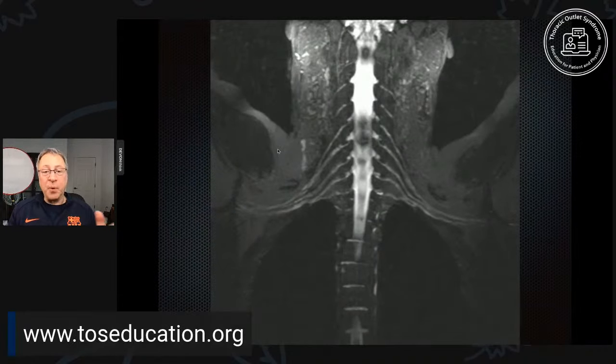And here's a picture of the brachial plexus on each side. We can lay out the brachial plexus, separate it out from the rest of the soft tissues. No other modality can do it this cleanly. The brachial plexus are these white cables or wires you see. There's 5 of them on each side, and they spread out from the spinal column, and they go into each arm and join together where they split and branch and rejoin again. Then they form the 5 nerves that go into each arm.